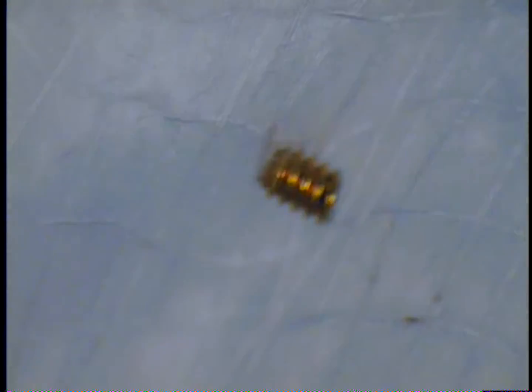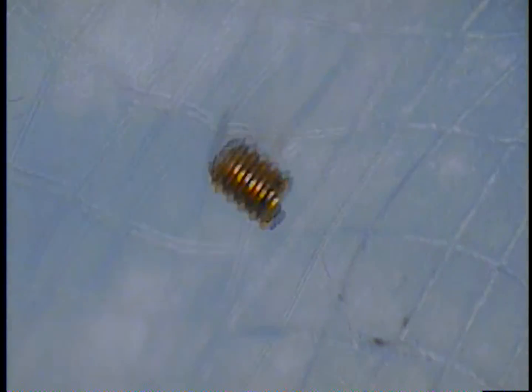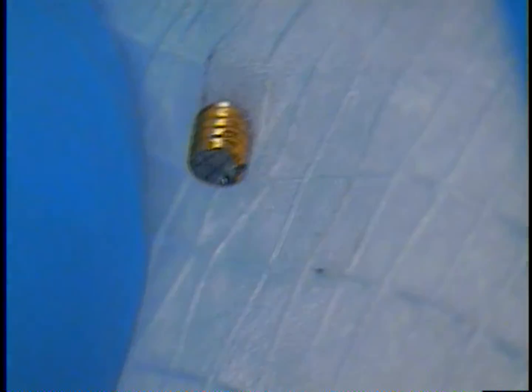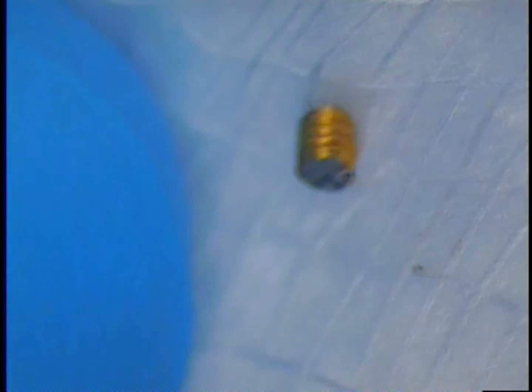And here it is. I am looking at it and the patient is looking at it right now — it is incredible that something that small can get in the way. But with the proper techniques and what I have been showing video after video, we can get these small little fragments out without any problem.